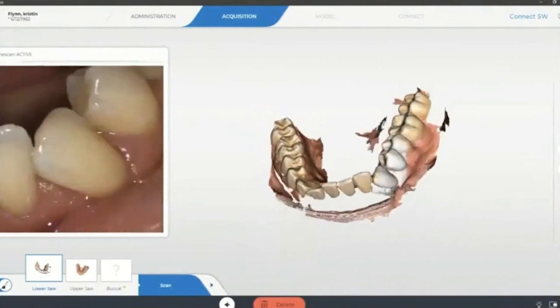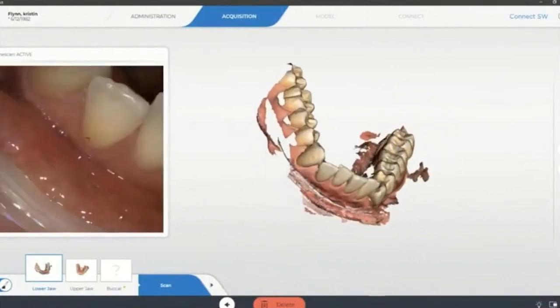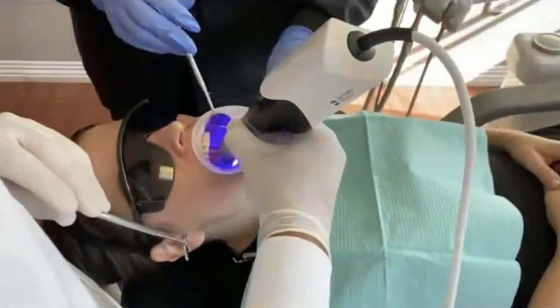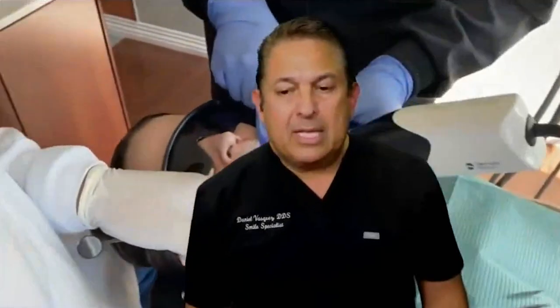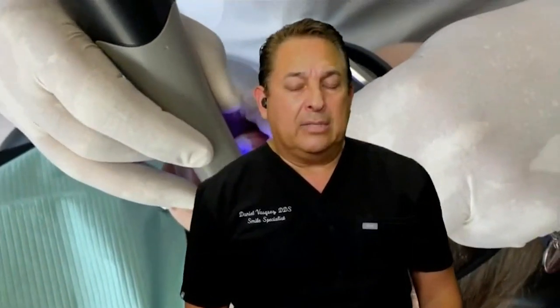So something very important that I want to touch base on. Yeah, you can print crowns. You can print bridges, implant crowns, hybrids. But I think one of the things that we've been using a lot is making night guards, or what we call our office orthotics. Okay.